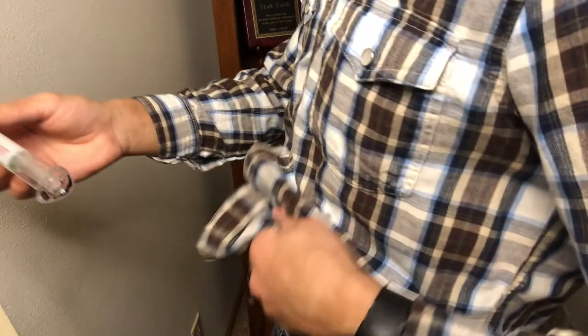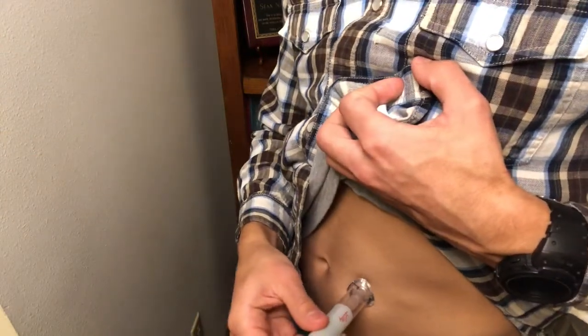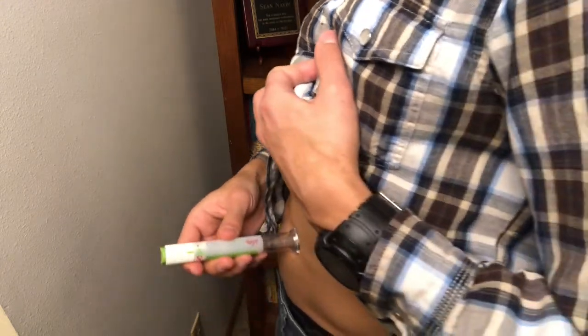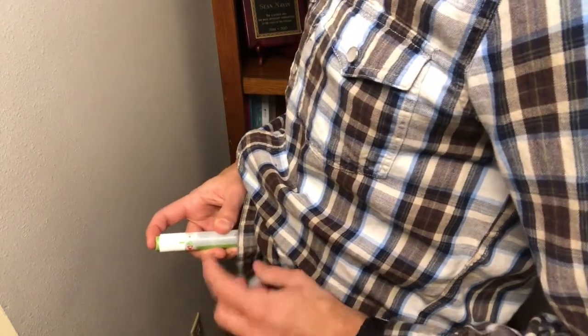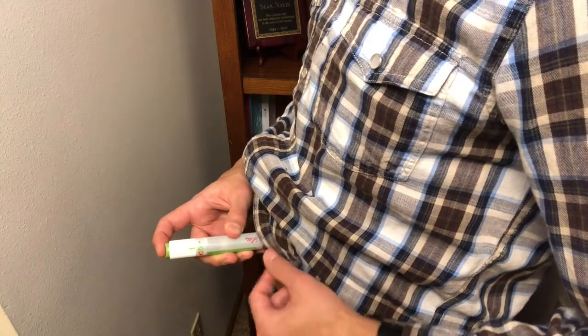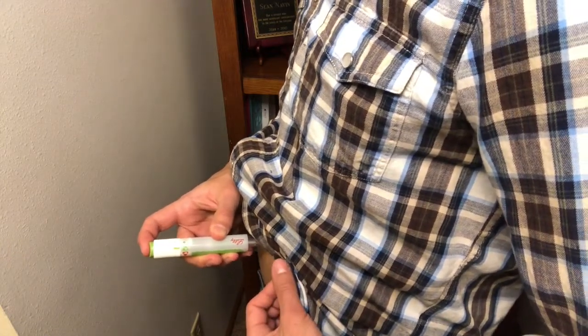So to now get the injection, again, I'm going next to my belly button. Again, anywhere in this region is fine. You could do the other side too. I'm gonna go right here. I'm gonna go down. And then now that I'm ready, it's unlocked. I'm gonna go ahead and push the button. And when I push the button, I'm holding the pen against my skin. Don't pull away yet. So I'm gonna push it.